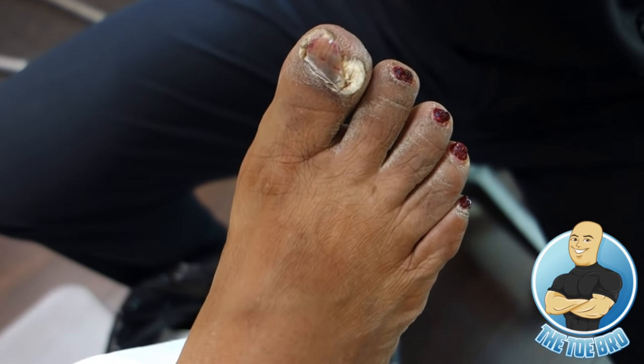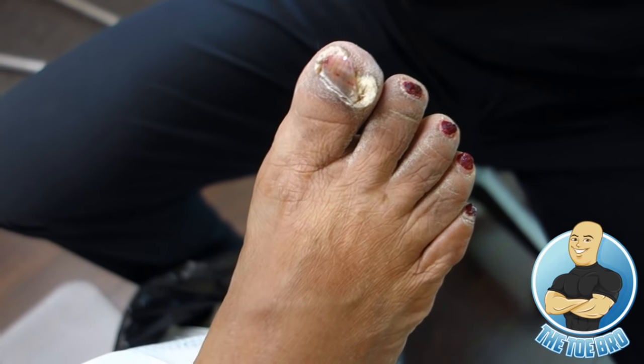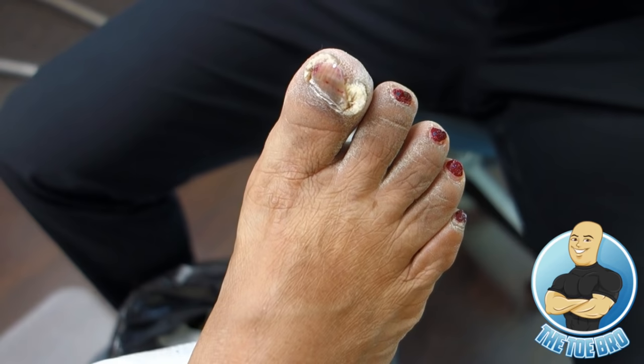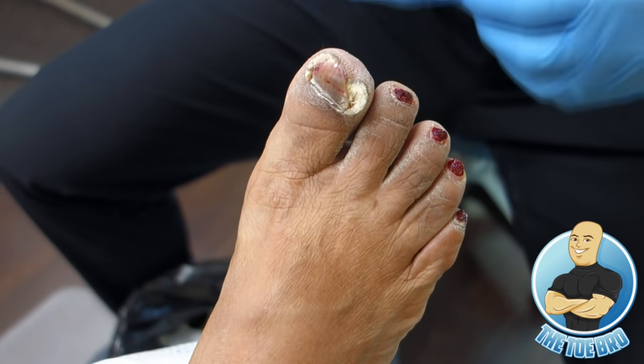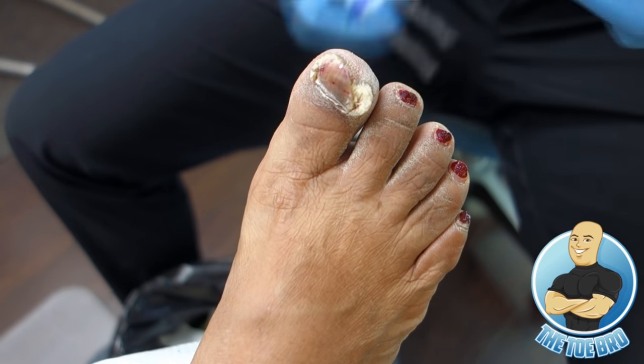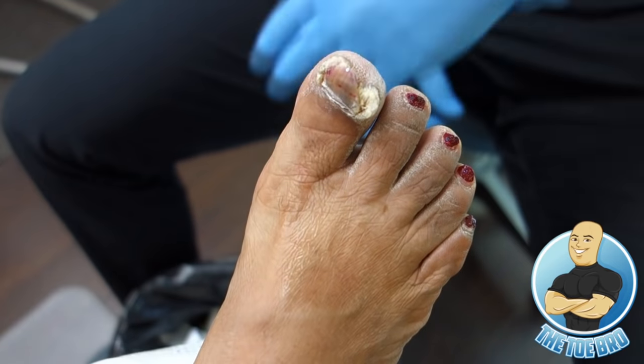As you guys know, it's time for another video, but today I'm not gonna have a photo. I'm gonna do some voiceover with the video. So today we do have something pretty interesting. We're gonna go right into it. So right now I'm just preparing the freezing. We're gonna freeze this toe. This is a very interesting case. It's one of the first that I've seen this bad.